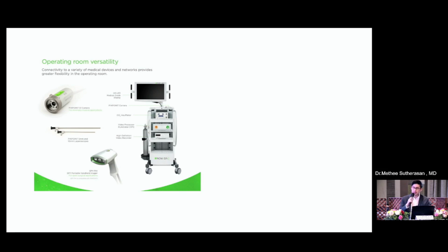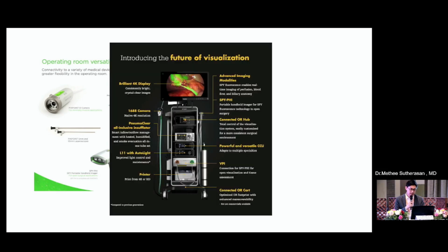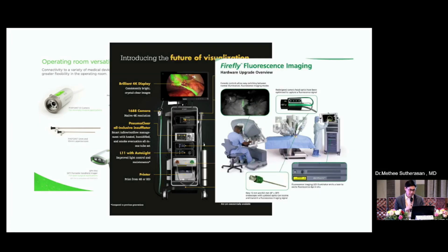At present, the camera system can be integrated with the laparoscopic system, maybe in every laparoscopic camera system, and also in robotic-assisted systems like the Da Vinci, where we call it Firefly.